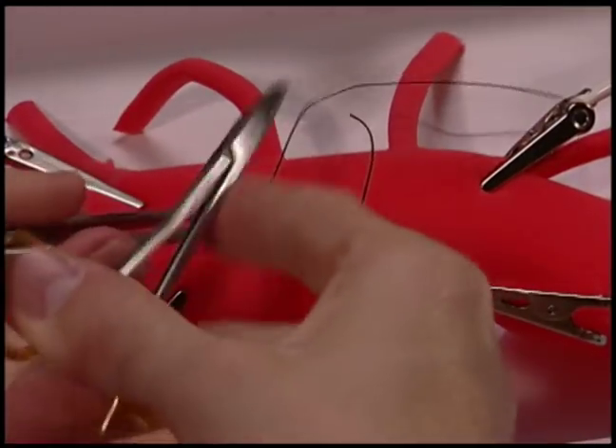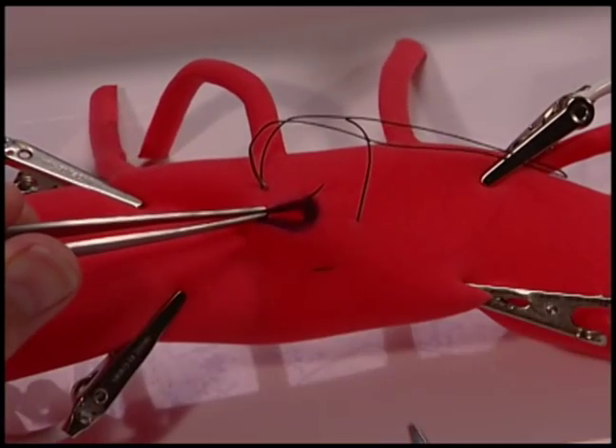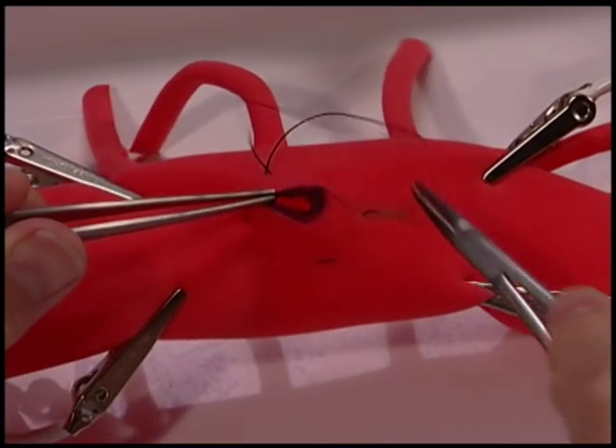Another common error is to come too close to the defect. By doing this, it prevents the defect from being buried.